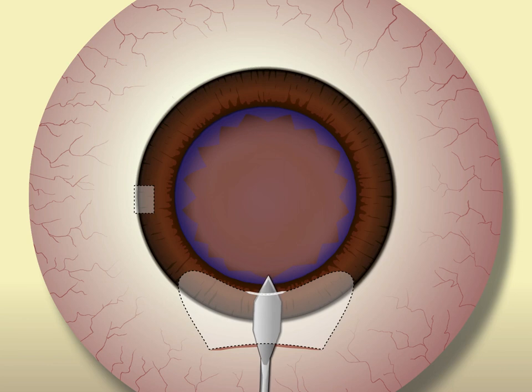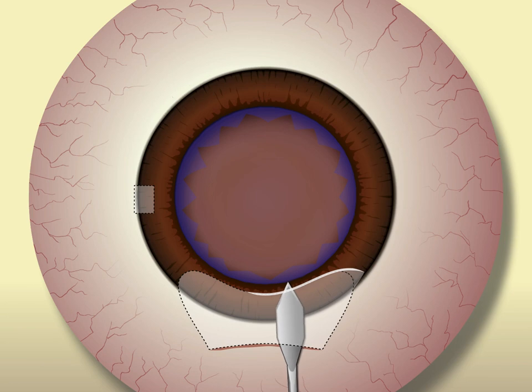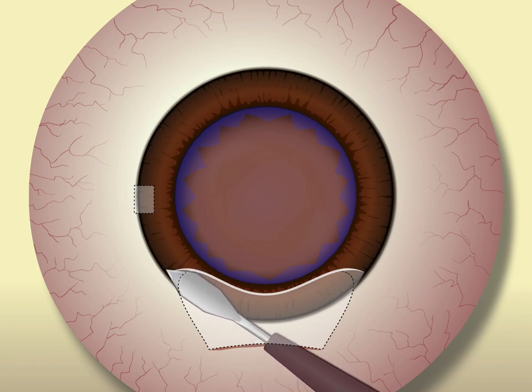After the anterior capsulotomy has been performed, the internal incision may then be opened fully with a keratome. To maintain the full extent of the internal corneal shelf, it is helpful to open the internal incision with forward strokes of the blade. If the incision is cut with downward strokes or in a saw-like fashion, it's much easier to lose the full extent of the corneal shelf that you've created.